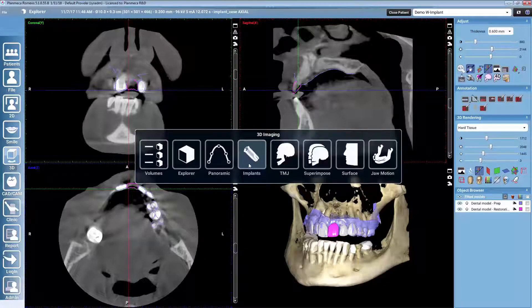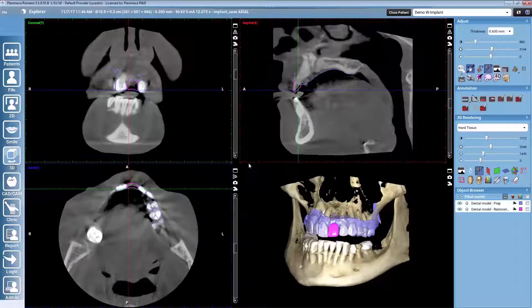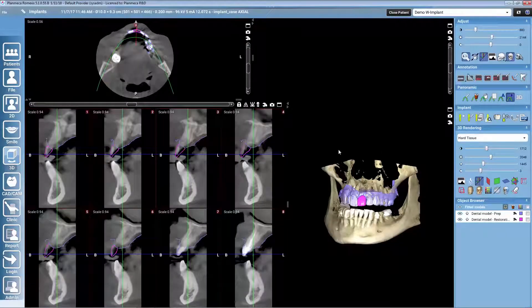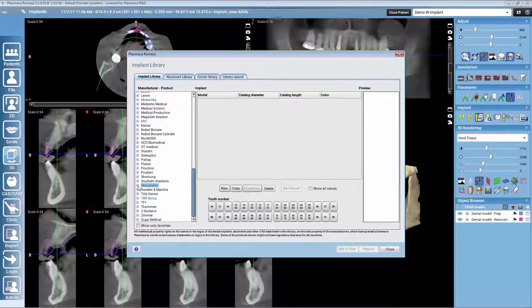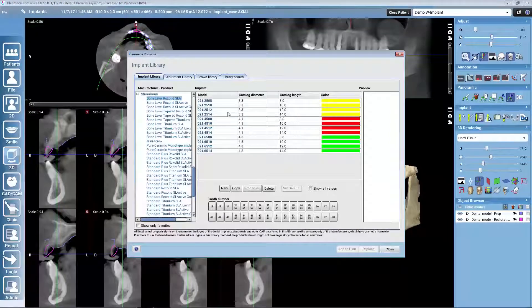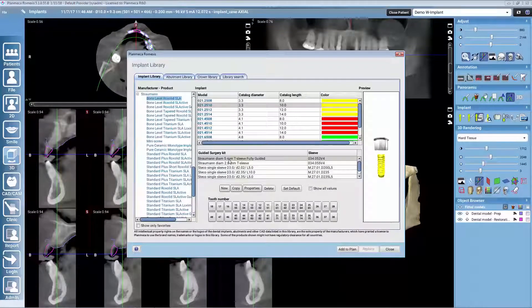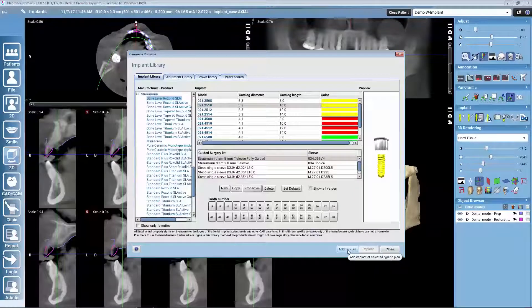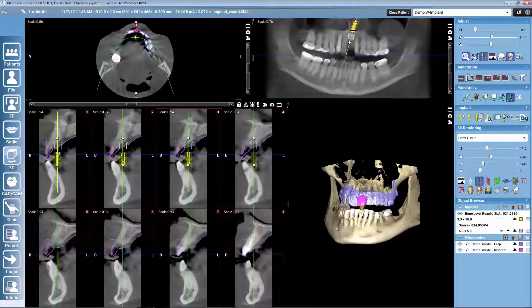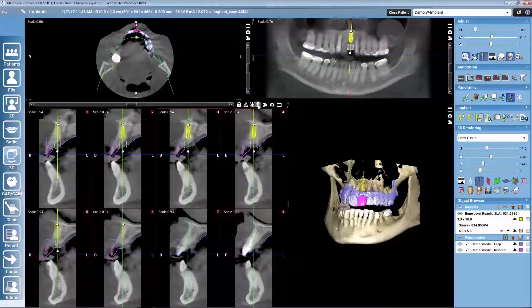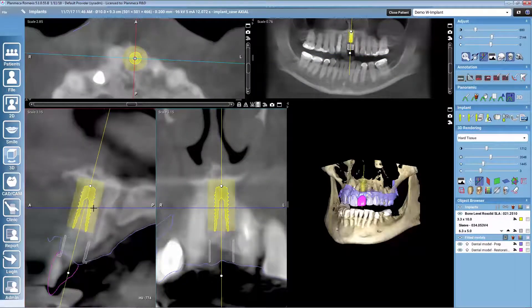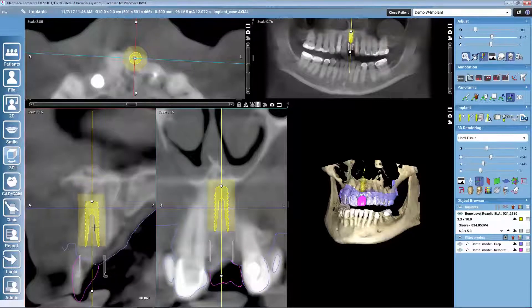From here we can move on to the implants planning module, where we go to the implant library to select our favorite implant. I will use Straumann in this demonstration. Once we select any implant from the library, Romexis gives us a list of the possible surgical kits. In this case I will use Straumann's own sleeve. We add to plan, and then I will use the implant-centric view to place the implant well — these two slices are always centralized in the implant.